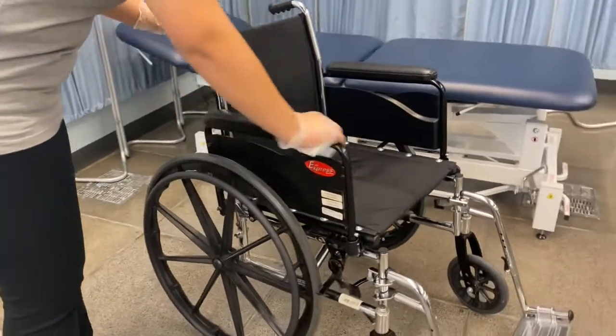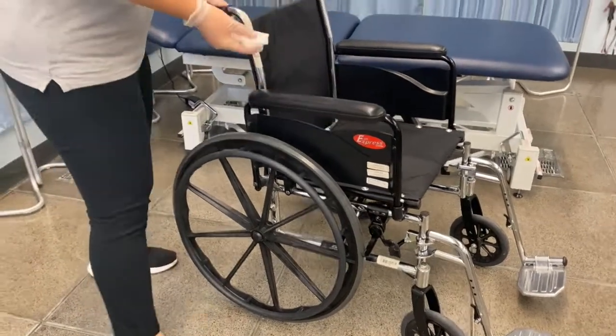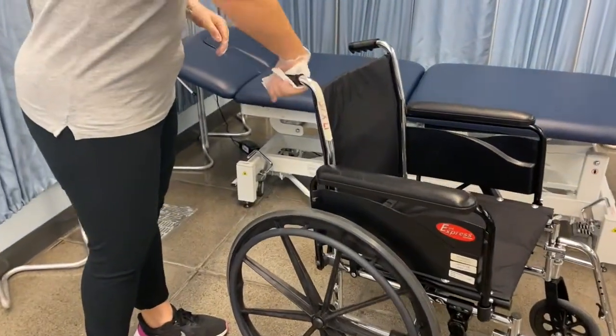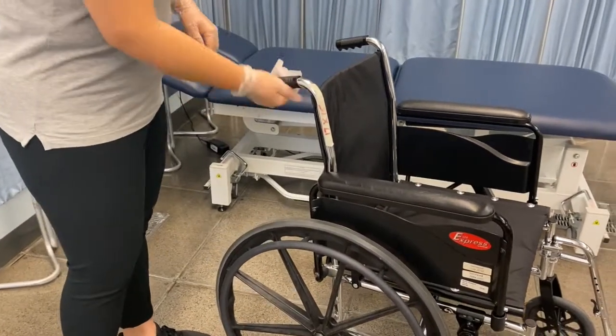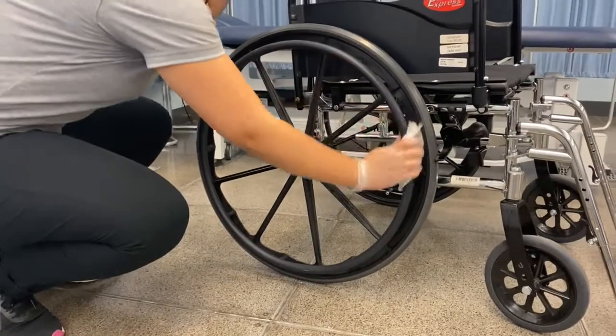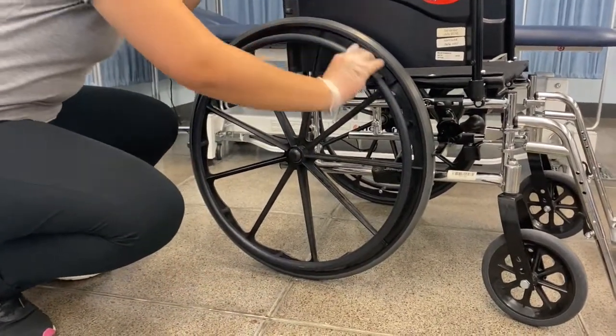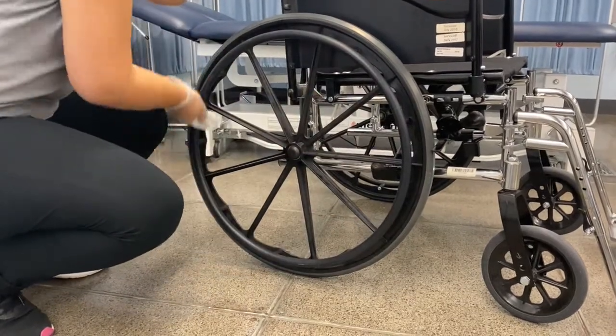then to the armrest of the wheelchair, the push handles of the wheelchair. Last but not least, disinfect the hand rims. Make sure you are wiping down the entire surface of the hand rim, and repeat the steps on the other side of the wheelchair.